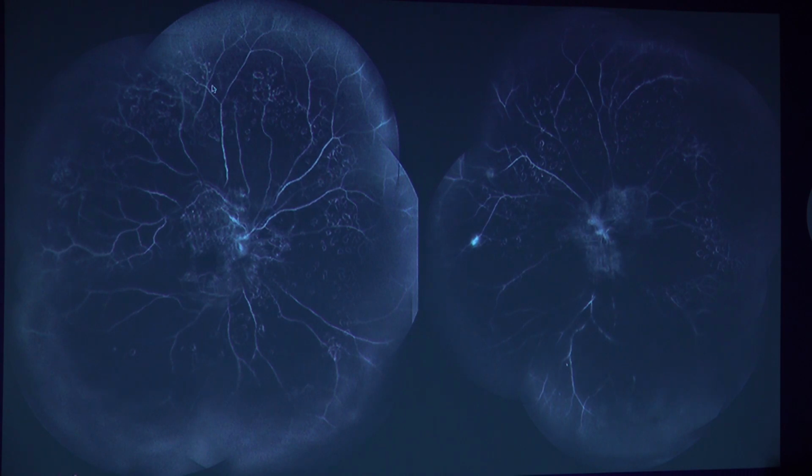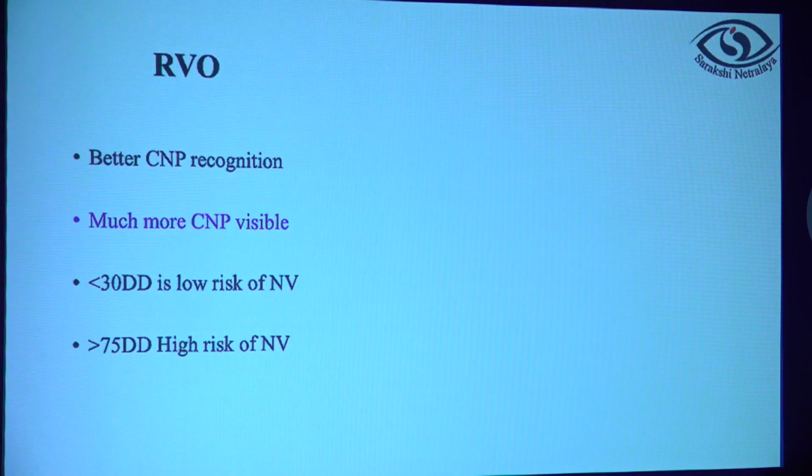These wide field angiograms in diabetic retinopathy in certain cases now challenge that concept, as there might be ischemia anterior to the equator. And second thing is, treating these areas would also help in reducing the macular edema in certain cases, as well as in neovascularization.